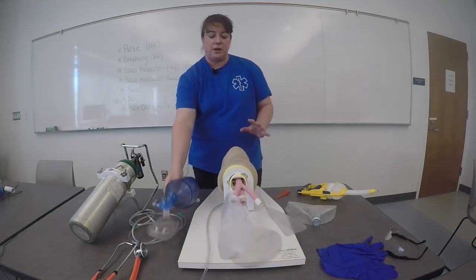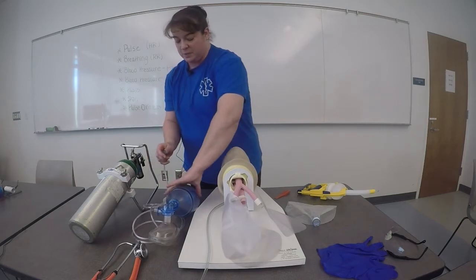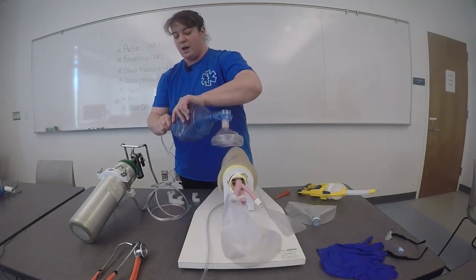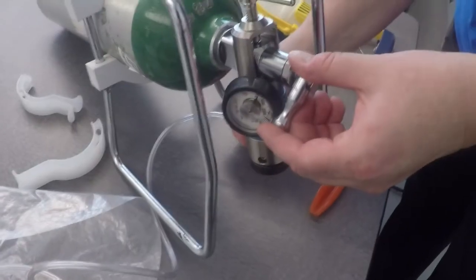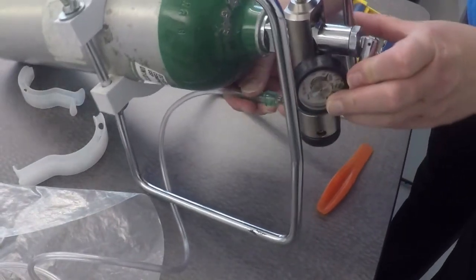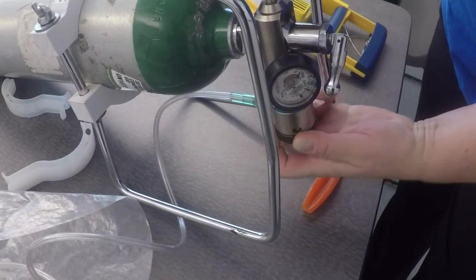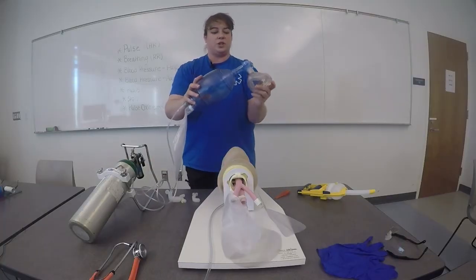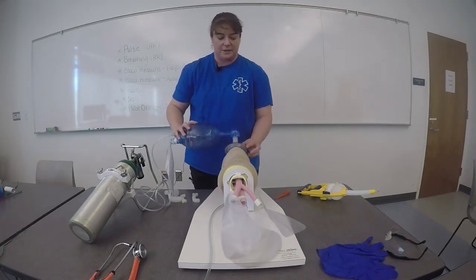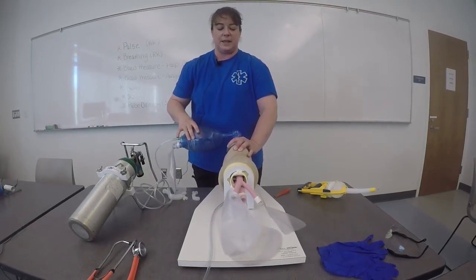I'll pause momentarily and check the pulse. The patient still has a pulse but is not breathing. I'll attach my oxygen tubing to the base of the bag and to the regulator. I'll make sure the tank is turned on. I will then attach my reservoir and turn to 15 liters per minute. Make sure the oxygen is flowing.